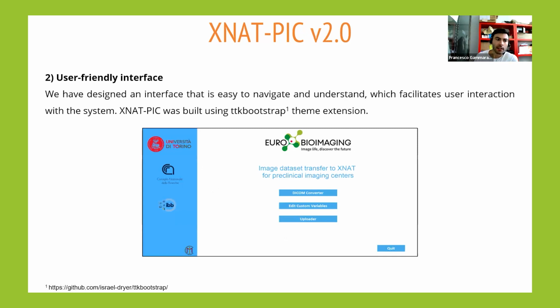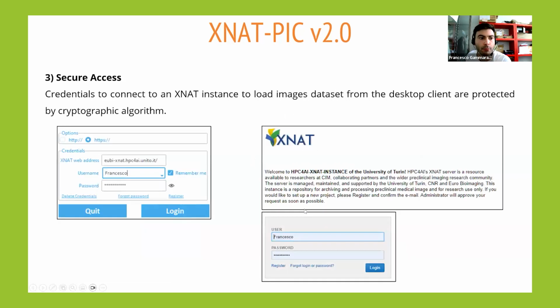We have designed XNAT-PIC with a user-friendly interface inspired by Bootstrap. This picture shows you the main interface where we have three options: the DICOM converter, the button to open the dedicated interface for custom variables, and the uploader.